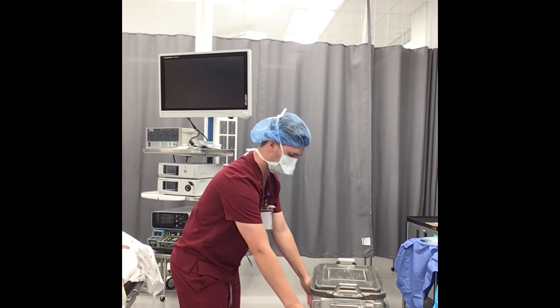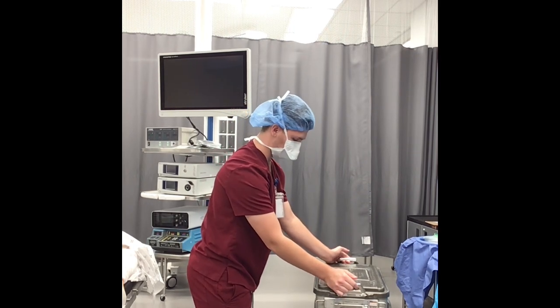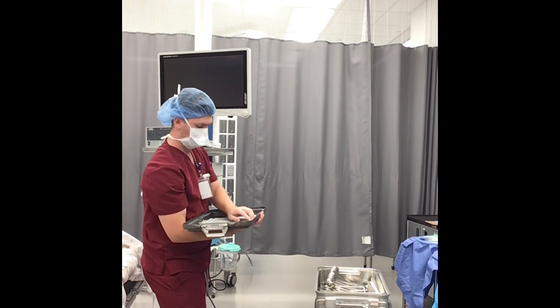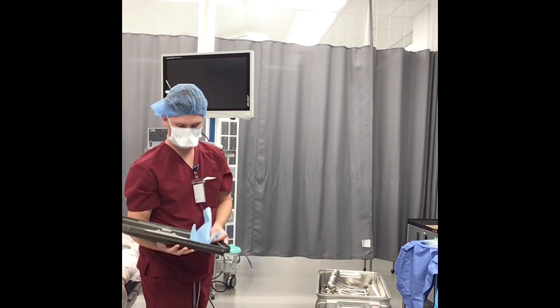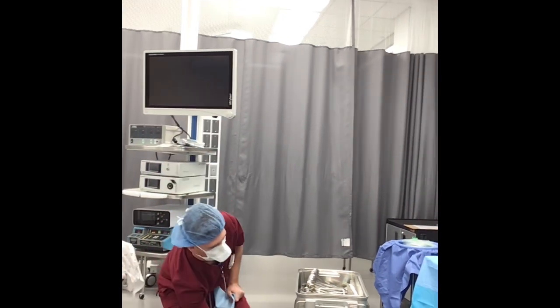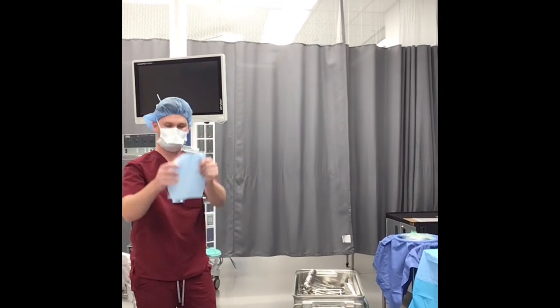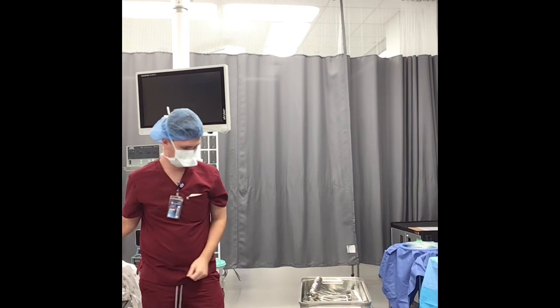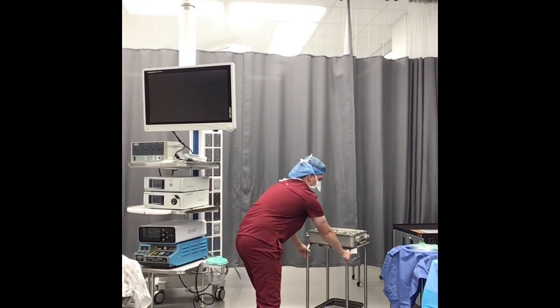Okay. And the next thing I'm going to do is open this up just like a hot pan. So I'm going to kind of rotate back and away. Now my top filter here, so I'm going to go ahead and take this lid off. This can go here. Notice again how I'm bending at my knees and not at my waist. Okay, and I'm going to check my filter for any holes, rips, or tears. And then this is going to go back over here.